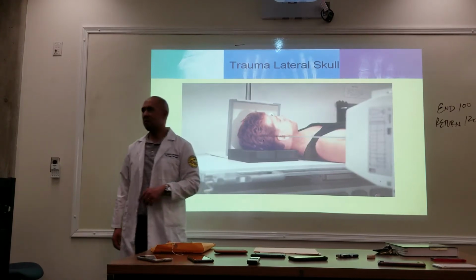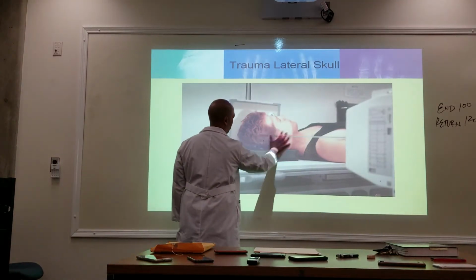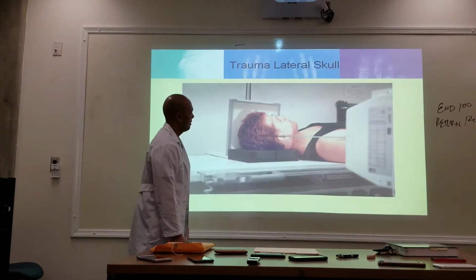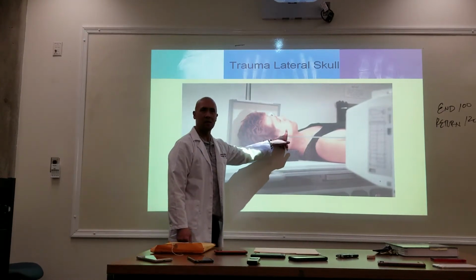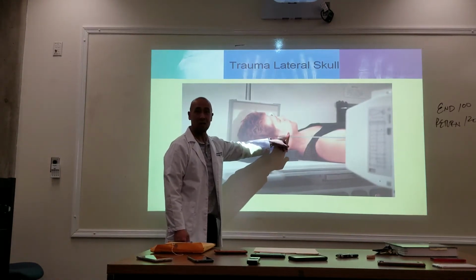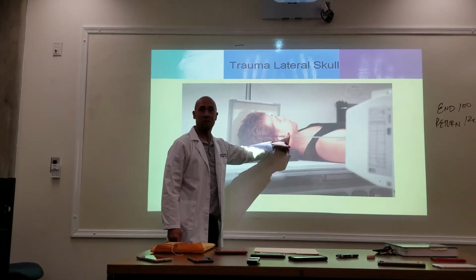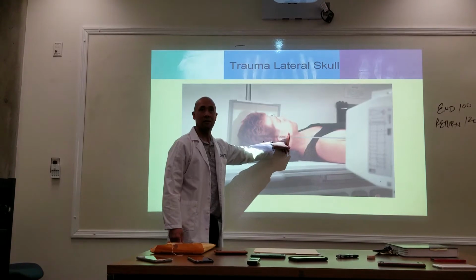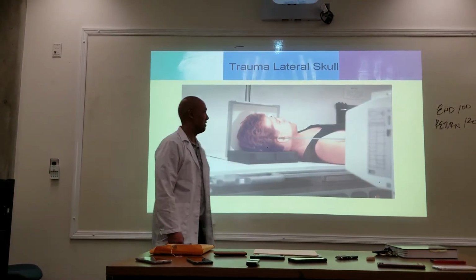But you guys also see something weird about this image here. Are we getting the entire skull in the image? Yes or no? We don't get the mandible, right? Do we care about the mandible? No. We care about the skull. So we don't care about the mandible. So if we're cutting that off, so what? Then order a mandible. Order a mandible. That's a separate study. It's not part of the skull.